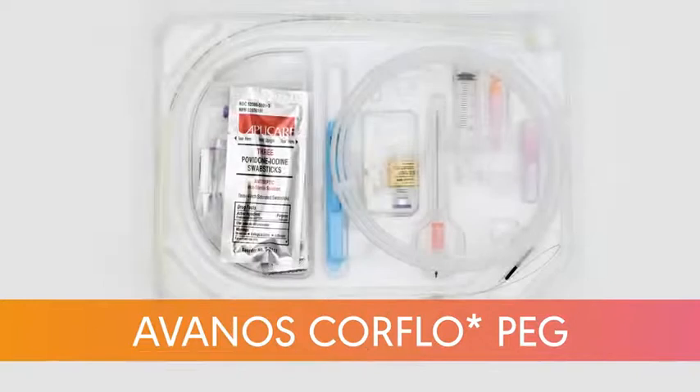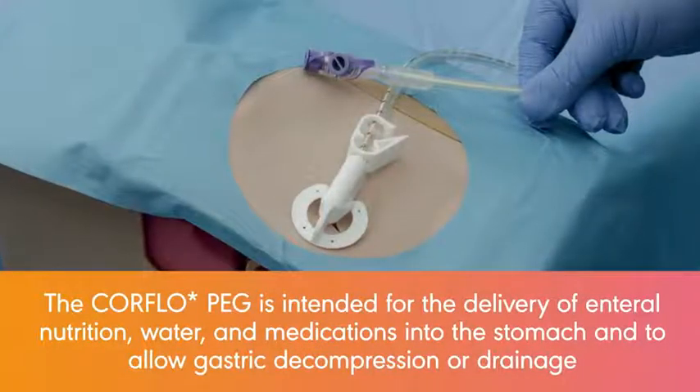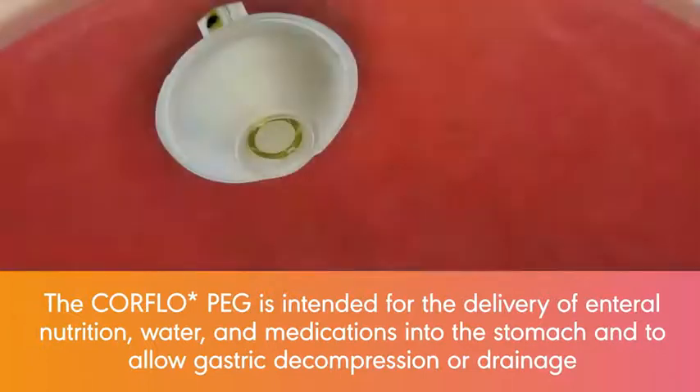This video demonstrates how to use the Avenos CoreFlow Safety Pull & Push Peg. The CoreFlow Peg is intended for the delivery of enteral nutrition, water, and medications into the stomach, and to allow gastric decompression or drainage.